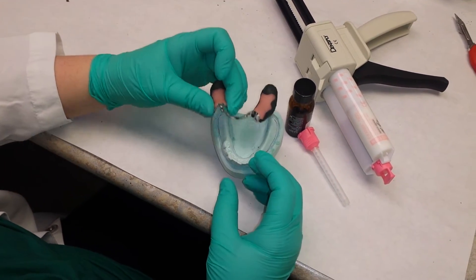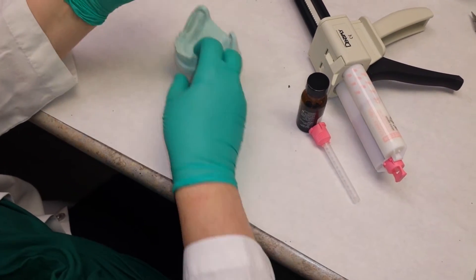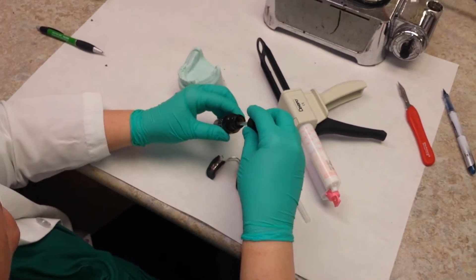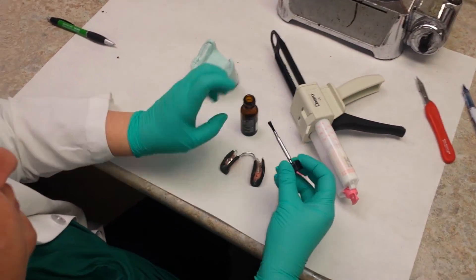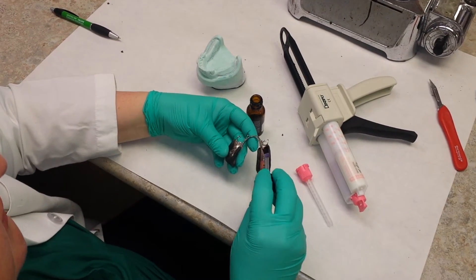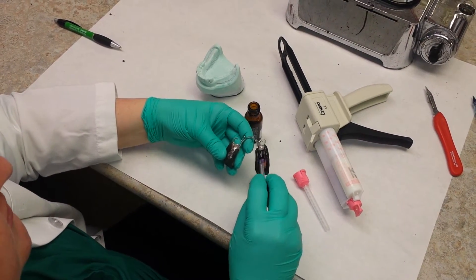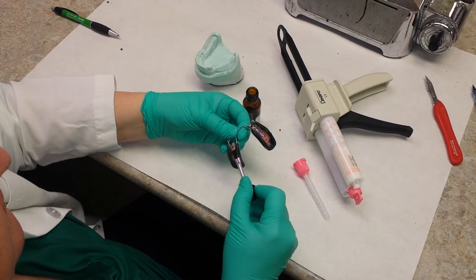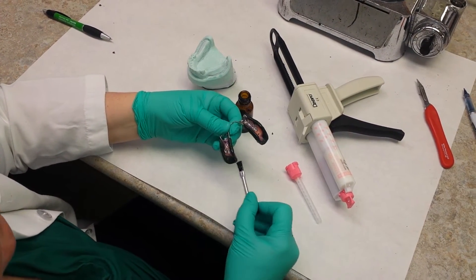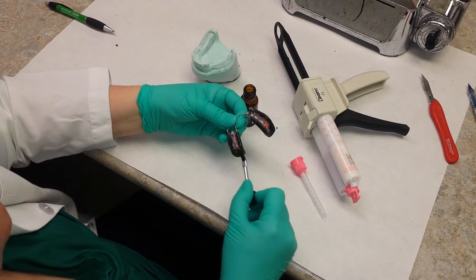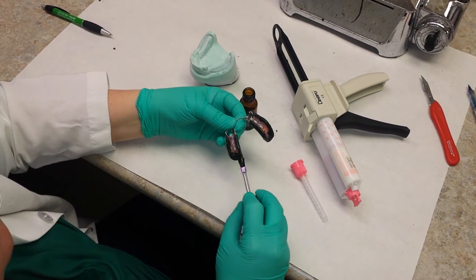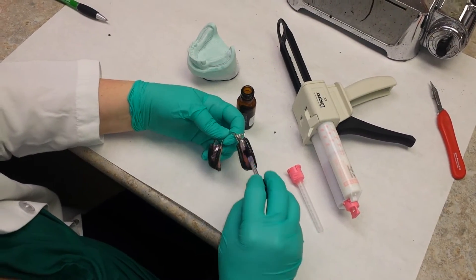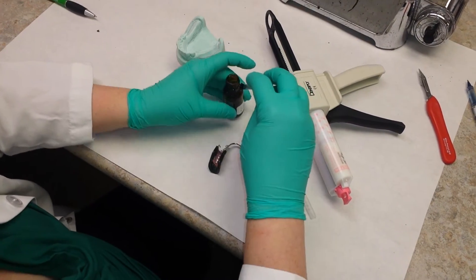Normally this would be the patient's mouth that we're doing the border molding. So now it's time for the impression. Because we're in the lab, we can just use this brush. If you were working in a patient's mouth, you don't want to use this brush for adhesive. You want to use a separate brush for each patient and pour it out of the bottle for each patient. But in the lab, it's fine to just use this adhesive material.